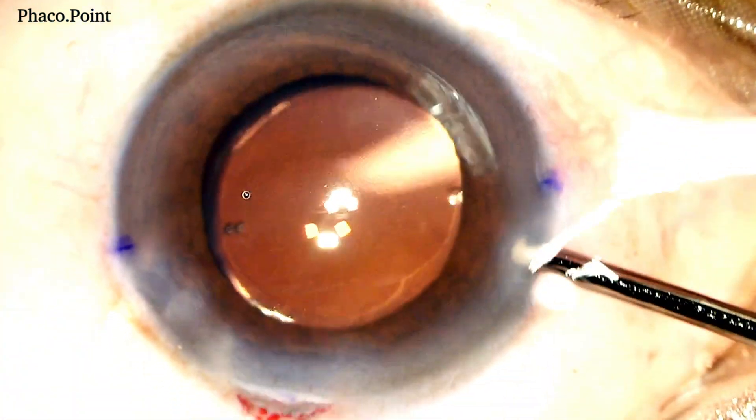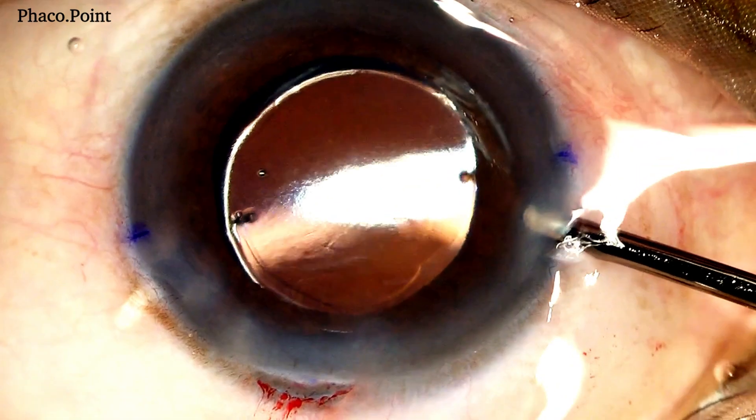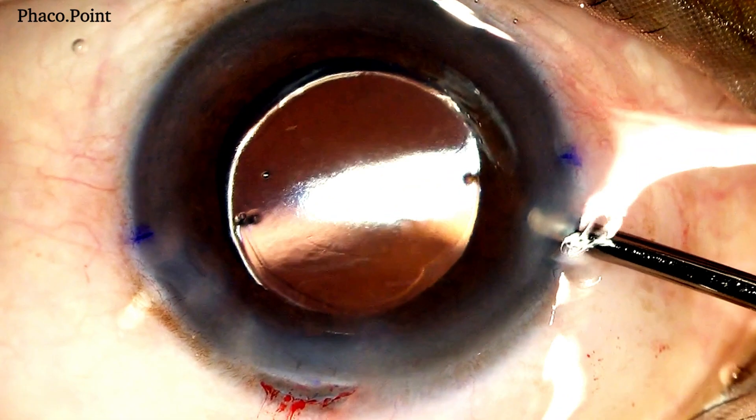Once more, I'd like you to see how the two Purkinje images are completely superimposed on each other and the marks on the IOL are completely in alignment with the marks on the cornea.